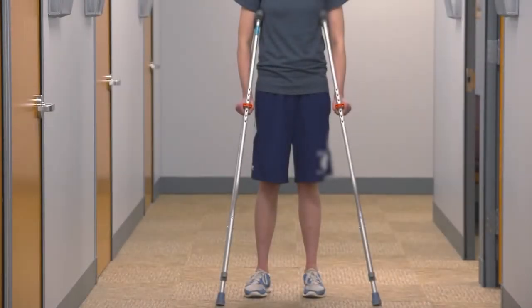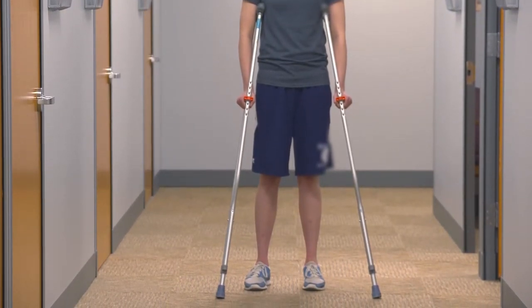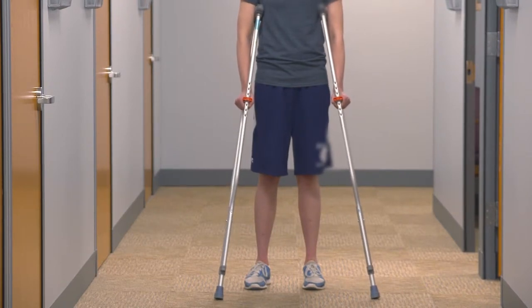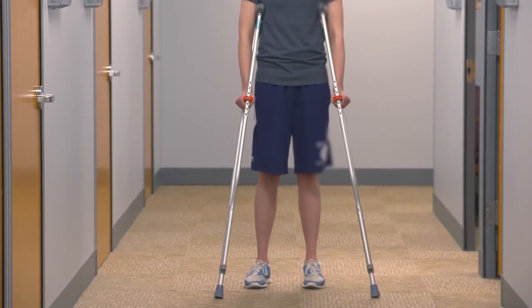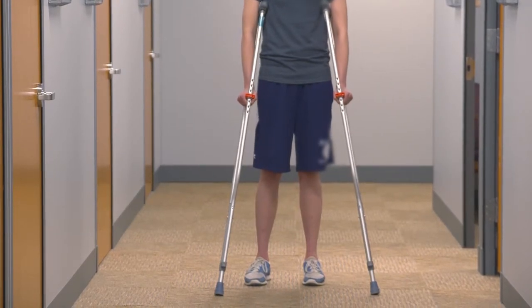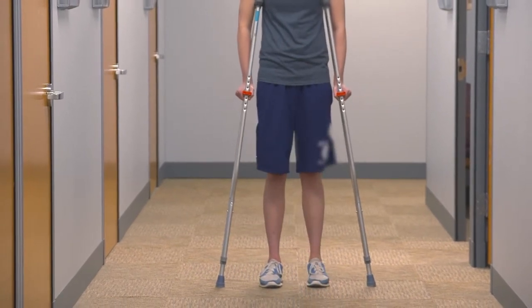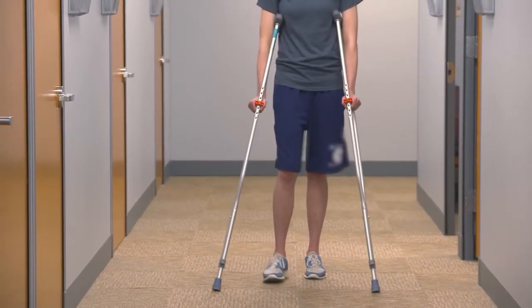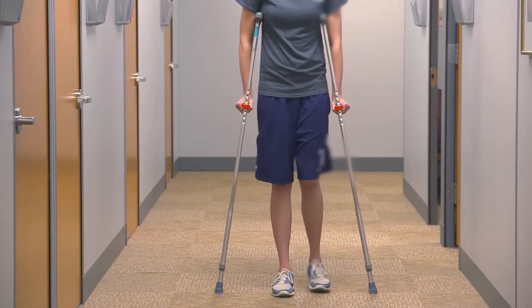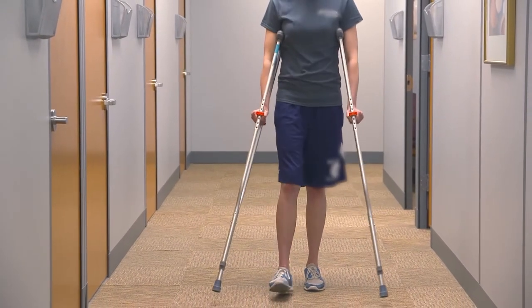Stand with the crutches under your arms with the palm of your hands on the handles of the crutches. Position the crutches at a 45-degree angle from your feet, slightly forward and away from your body. While maintaining an upright posture, advance your surgical leg to the crutches. While applying weight through the surgical leg and the crutches, advance the non-surgical leg forward. The weight distributed through the crutches will be placed through your hands. Continue to repeat this sequence.